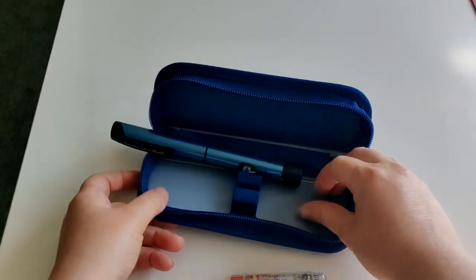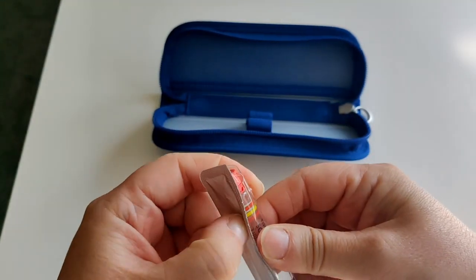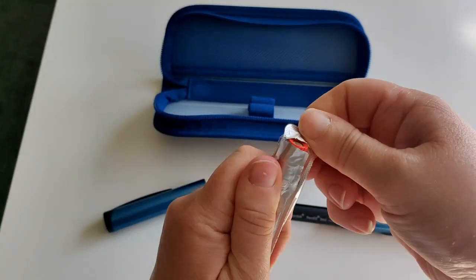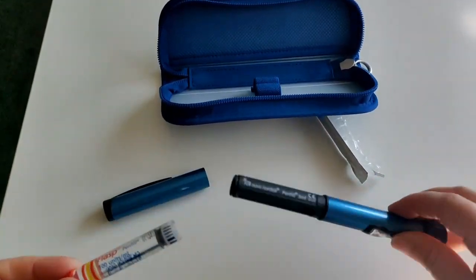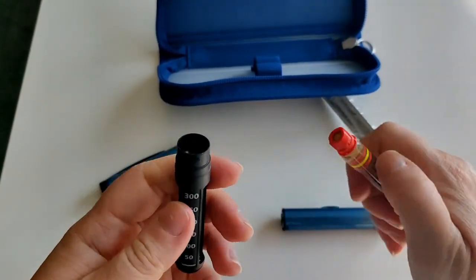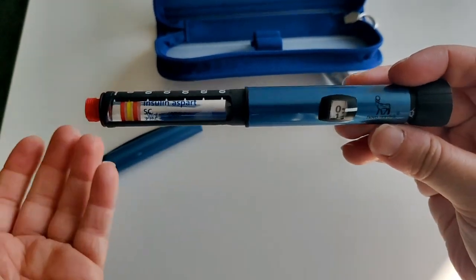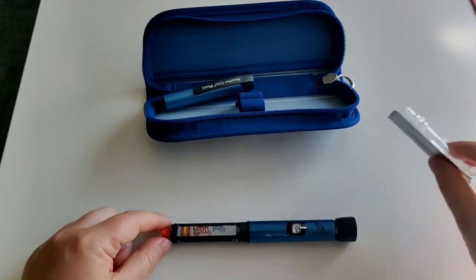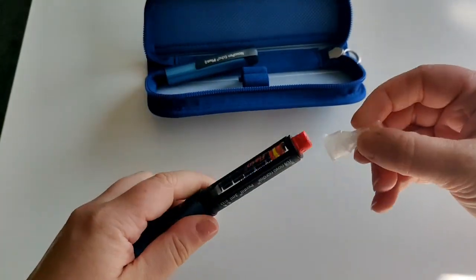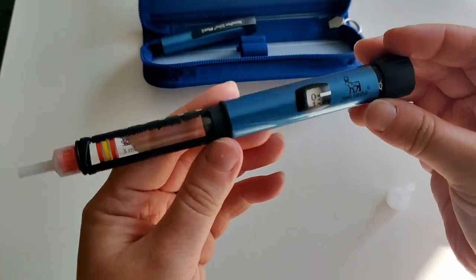For anyone who doesn't know, I use Fiasp — that is my insulin. This is a vial of Fiasp; you can get it in its own disposable pens, but I really like these reusable pens. To prepare: we get it ready, put the vial in, simply twist it back together — and that's the insulin cartridge inside the pen. I'm not going to inject at the moment because I'm not eating, but I will put on a needle. The needles I use are GlucoRx four millimeter needles.